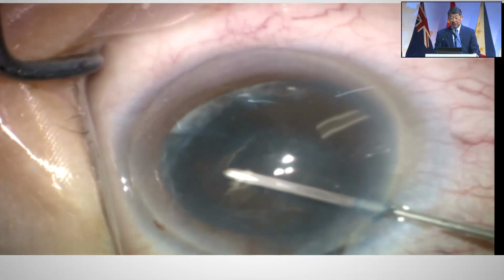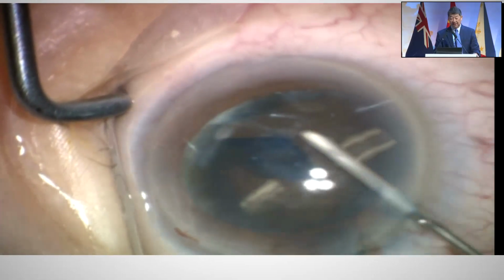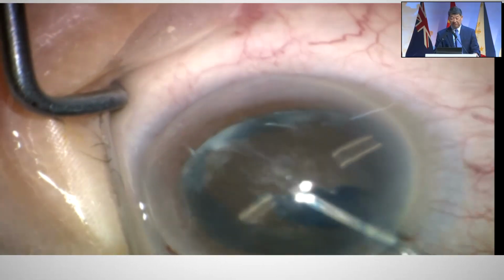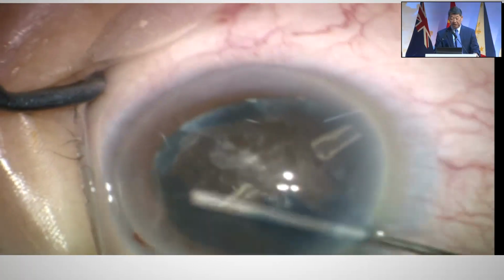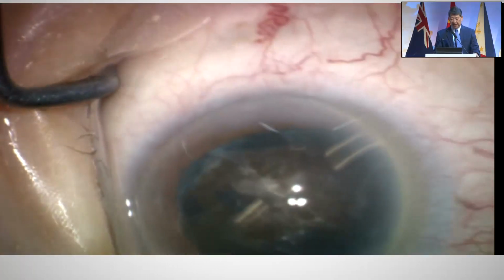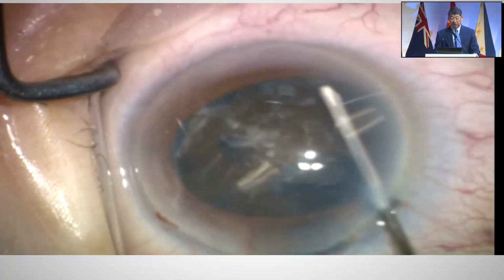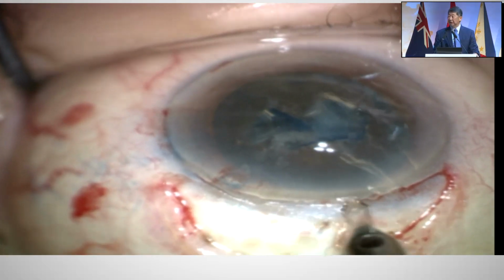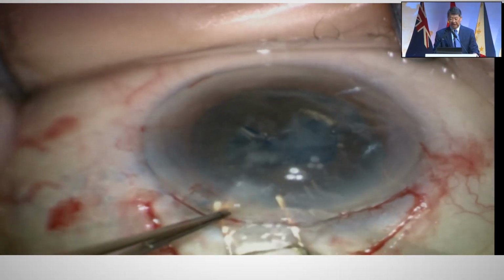Finally, here, look at, this is a dense lens, and look at how much phacodonesis I have just to complete the rexis. And our younger colleagues who aren't experienced in extracap really should learn how to do this, and we should do this more often. And that is what? I'm making a can opener, I'm moving superiorly, converting to a manual extracap.